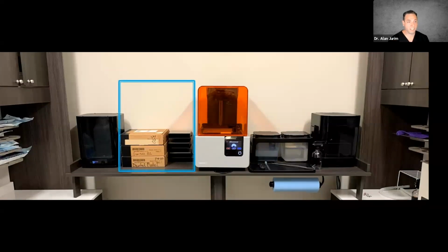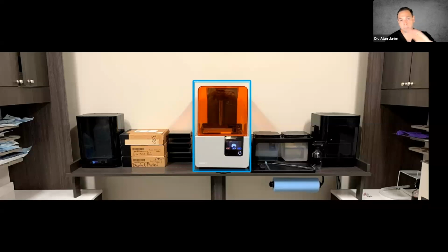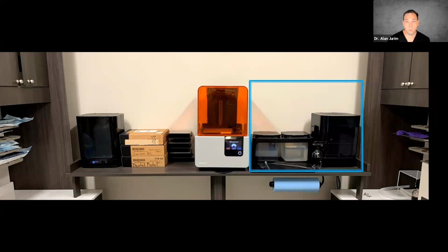So if we begin, we have some of our additional build trays and also some of our tanks. And if you see, we write the material on the box. There's denture B1, there's dental model there. But those are the materials that we use the most frequently. So the tanks are right there, right next to the printer. Once we've loaded the right tank, we can start the print, and it's relatively easy for us to just get that process going. In fact, most of the time, I'll send the print off to the printer. It's waiting there, and the assistants will walk by, see that it's ready to print, make sure the right material is loaded, and then just hit start on the printer.